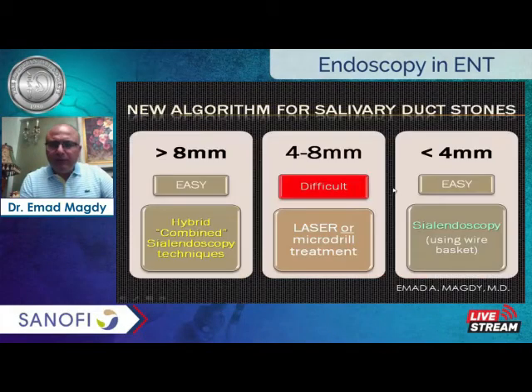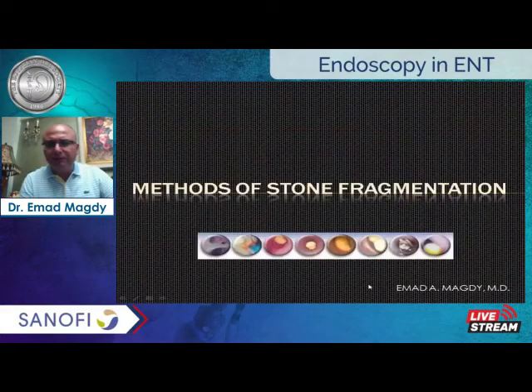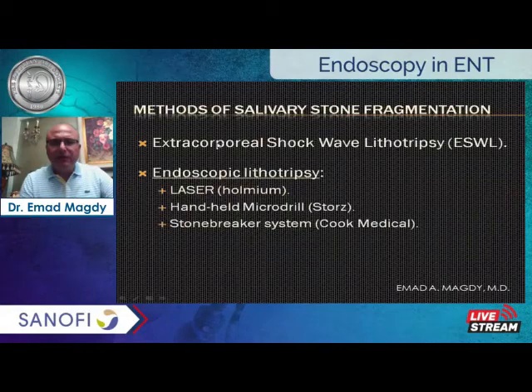Well, now if you're confronted with a 4 to 8 millimeter stone, these are a little bit more difficult. You have to do some sort of fragmentation, and there are several types of fragmentation you can use. The extracorporeal shockwave lithotripsy, which is very well known in the urology field, or you can do an endoscopic lithotripsy with either laser, microdrill, or what we call the stone breaker system.